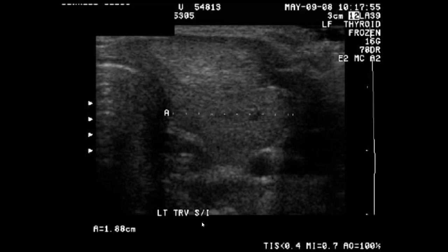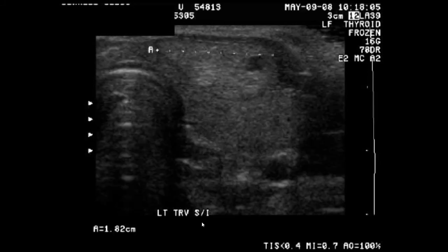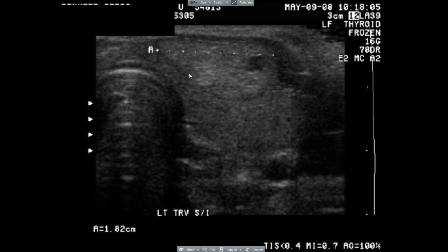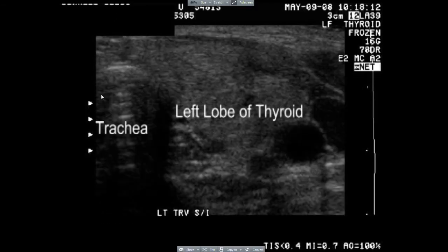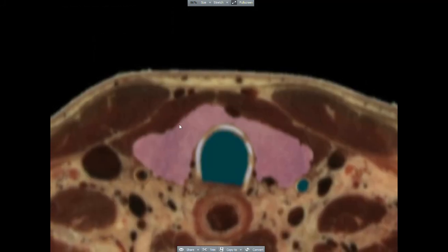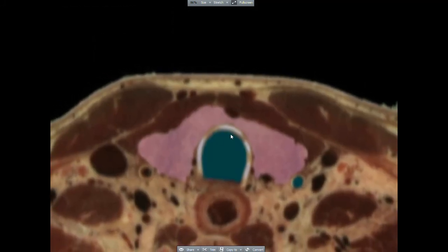Here we see another nodule, this one in the upper portion of the left thyroid gland. Notice here that the ultrasonographer has moved her probe now to the left lobe of the gland. We know because the trachea is medially.